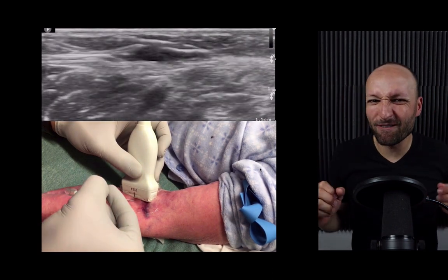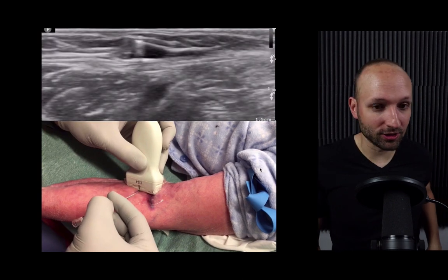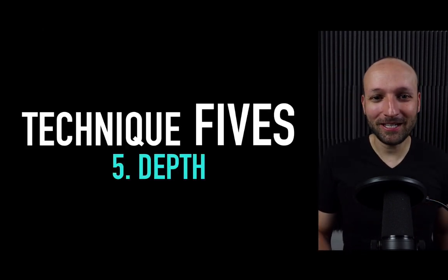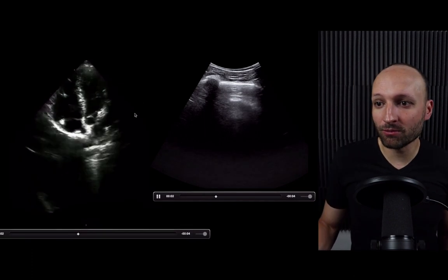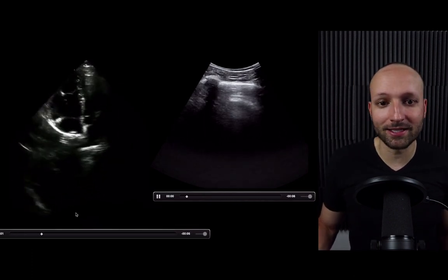You want to make sure that everything is braced so that you don't get fatigued and you have really fine motor skills. Depth. This is something that when I am doing image review for my residency, I often see these images. They might be great views, right? We have an apical 4-chamber view over here. We have a view of the lungs over here, but all of this is just wasted depth.